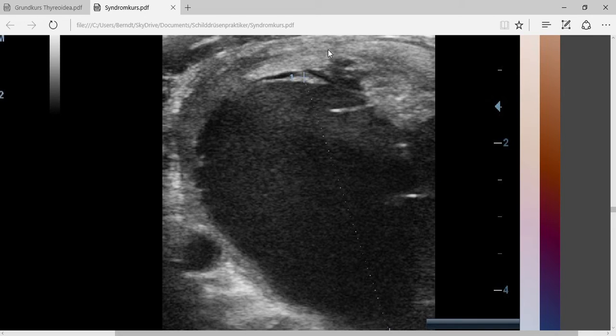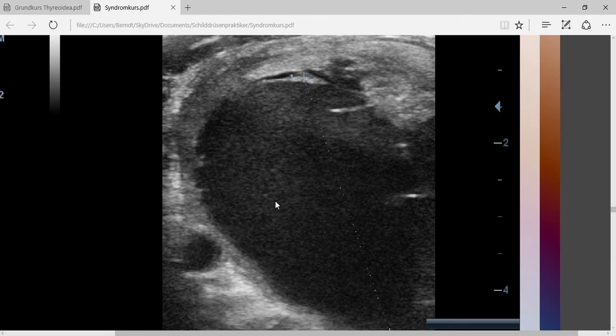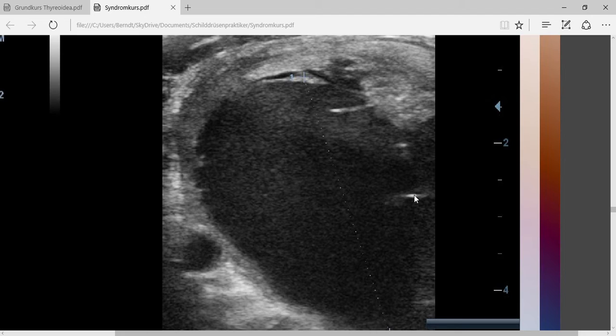If you look at it in the ultrasound, you can see that all the dark parts in here, that's a liquid. It would be interesting to know what that liquid is, because there are actually two common options.